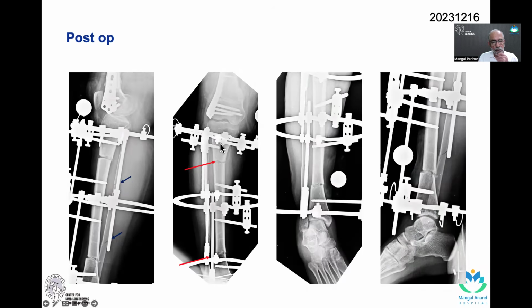Now the CORA was at this level, and the osteotomy, because we wanted good fixation, is slightly distal. So osteotomy rule number 2 comes into play. And because we are using a fixator, we don't need to worry about how much translation, etc. The fixator will accommodate for that as long as your fixator is put on properly.